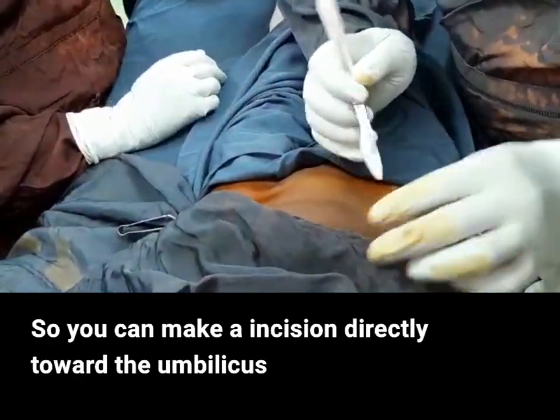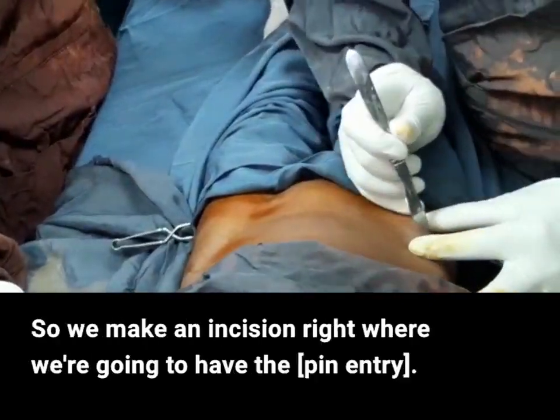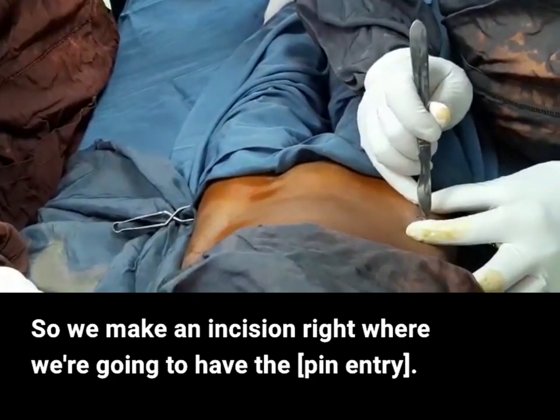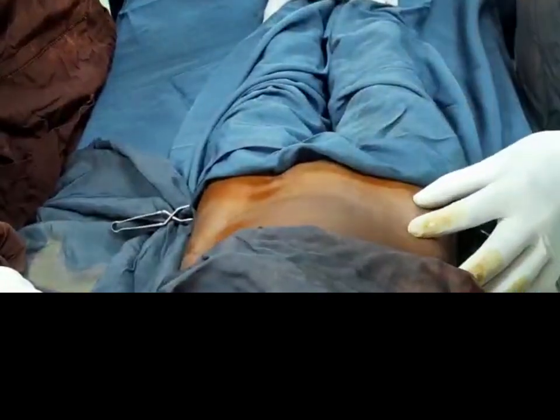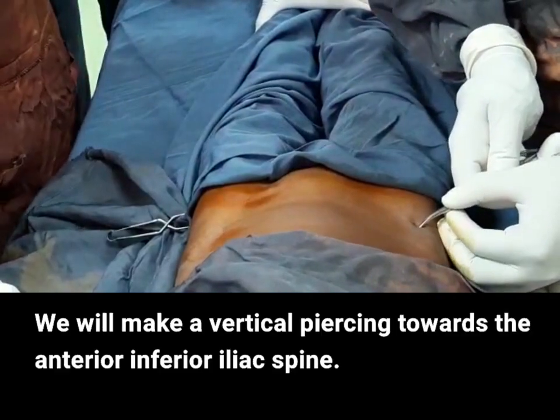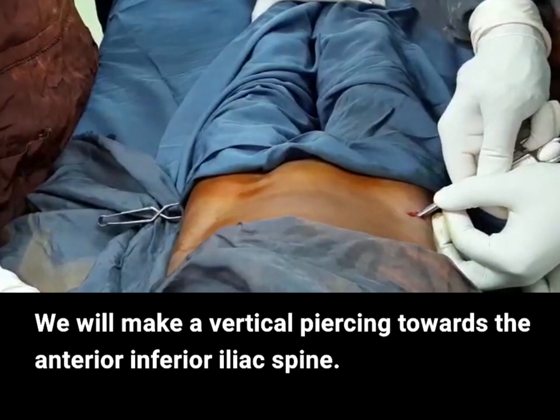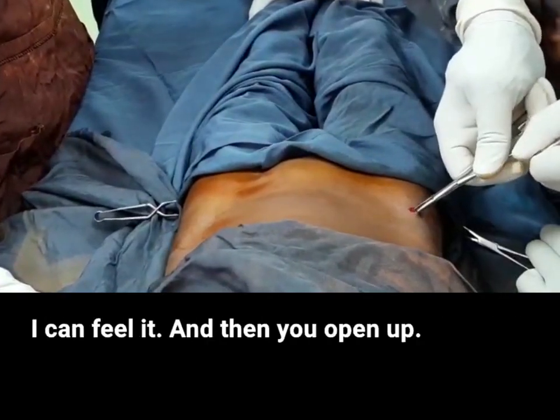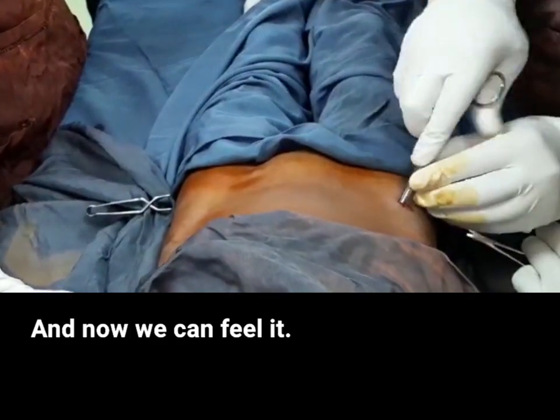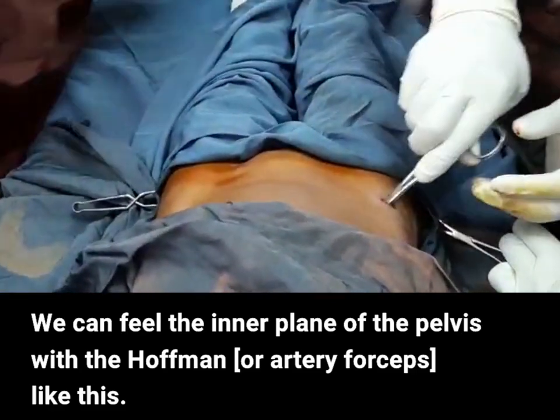You can make an incision directly towards the umbilicus or horizontally, depending on preference. We make an incision right where we're going to have a small arthrotomy. The incision is up to the dermis. We'll make a vertical piercing towards the anterior-inferior iliac spine — that's where the bone is. I can feel it, then you open up, slide it while it is still open, and now we can feel the inner plane of the pelvis.